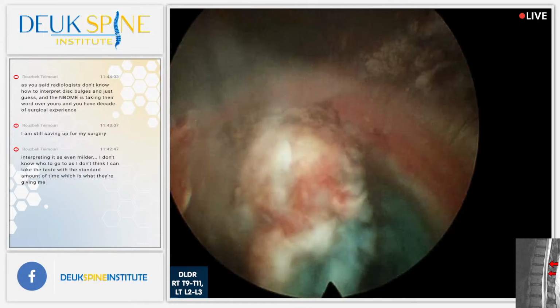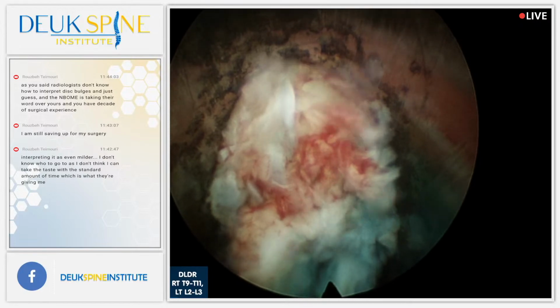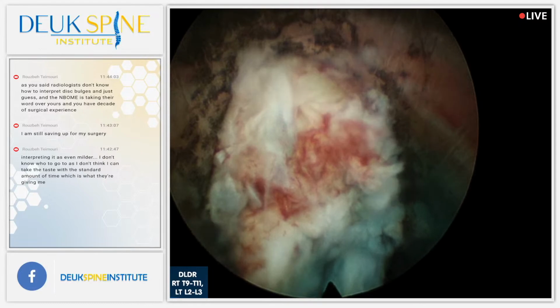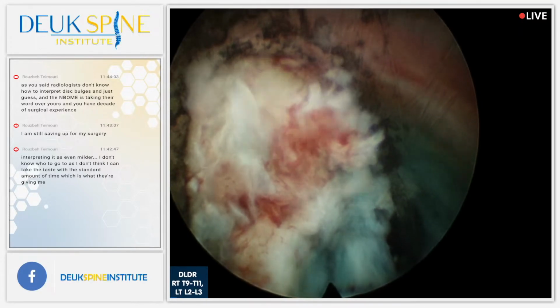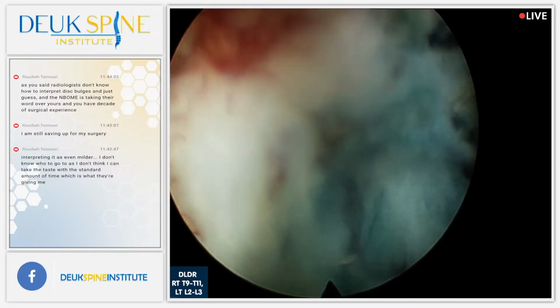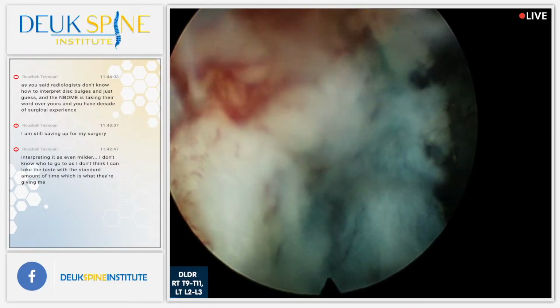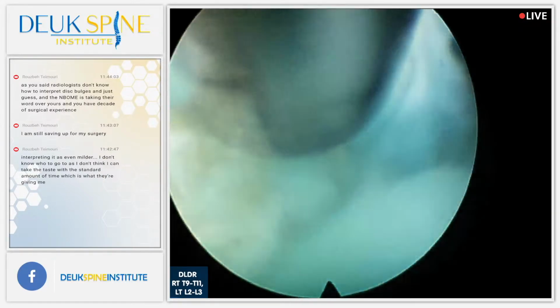Look at that. We're inside the disc. All right? What you're seeing there is the annulus fibrosus. And it's got some scar tissue in it. You've got the nucleus, which is blue. Now, normally the nucleus is white. It will not stain blue. So anything blue equals abnormal herniation. The reason it stains blue is because it's acidic.